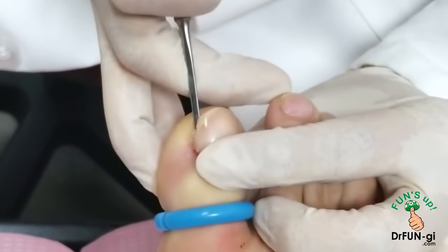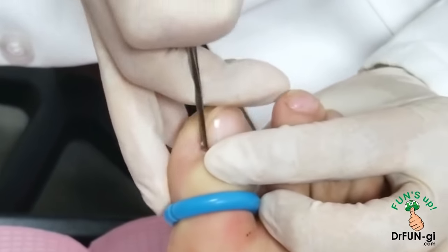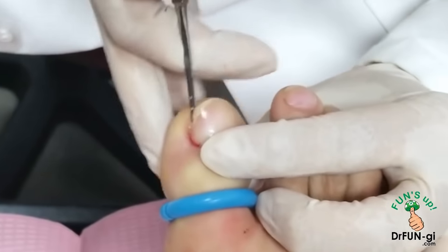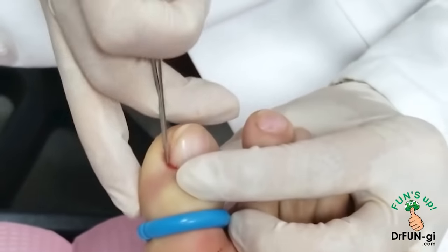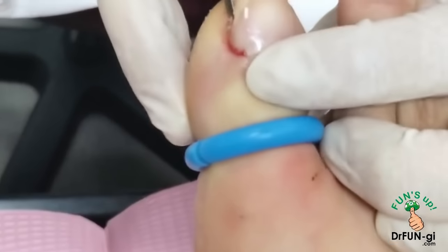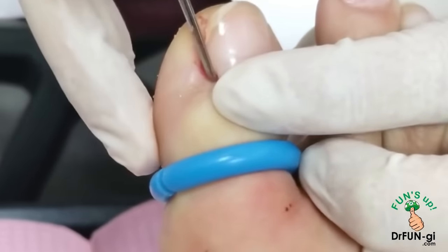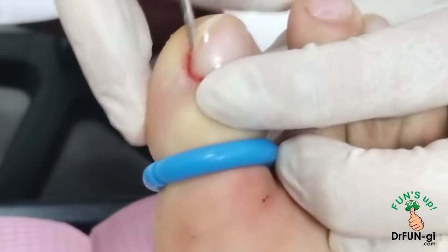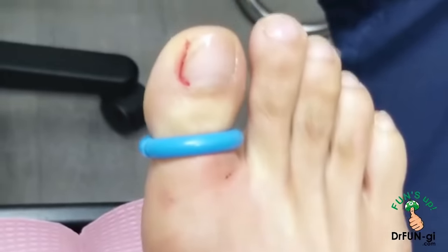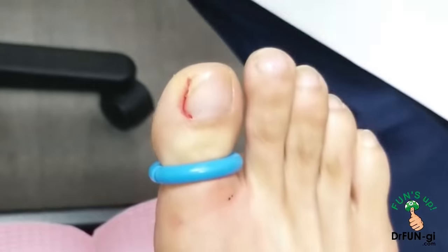We freed up underneath and on top, all the way to the bottom. This was really deep. Even though it's not infected, some of these nails are really deep and we don't want to leave anything behind, so we have to free up really well.